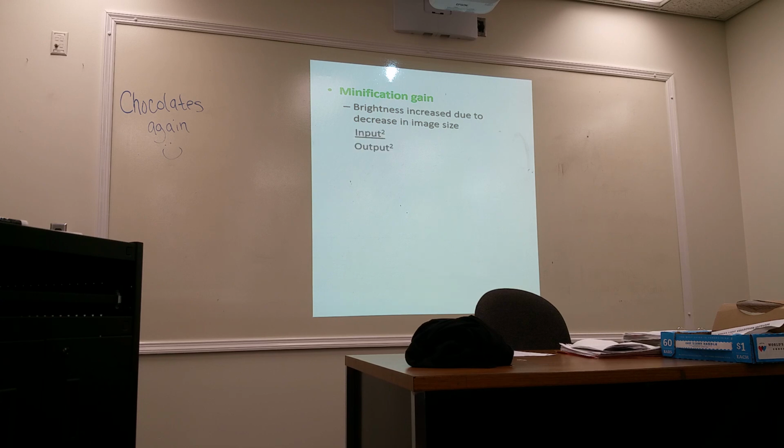So that is your input to your output phosphor, squared. This is why I love the output phosphor being 1 inch in diameter. Because what is 1 squared? 1. What is 12 squared? Well, there you go. Aren't you smart? Good for you.